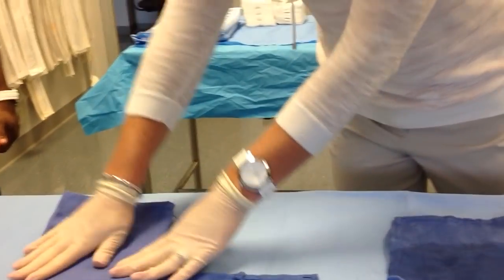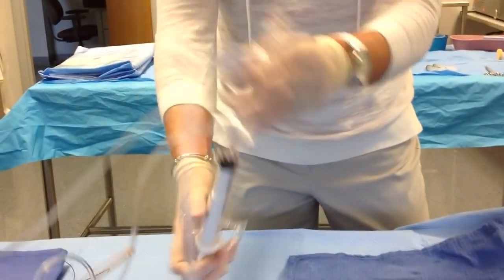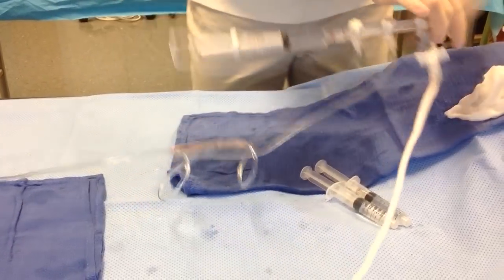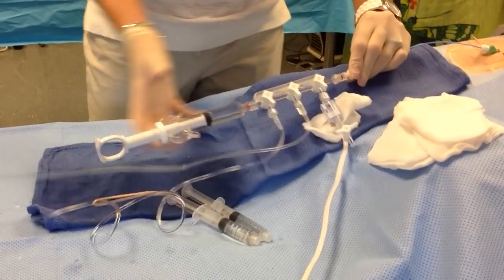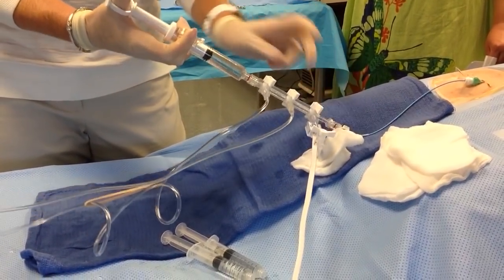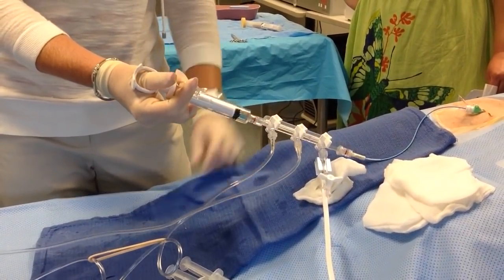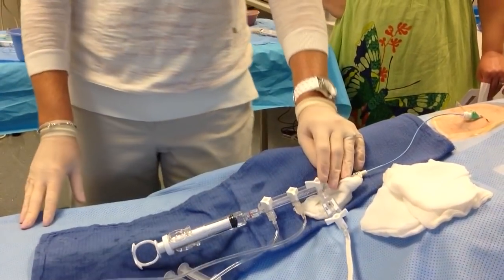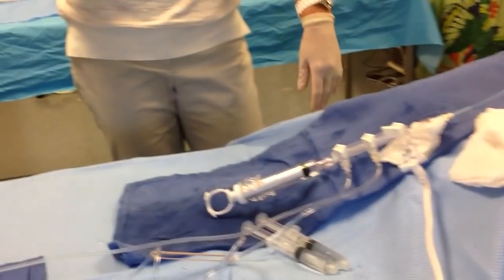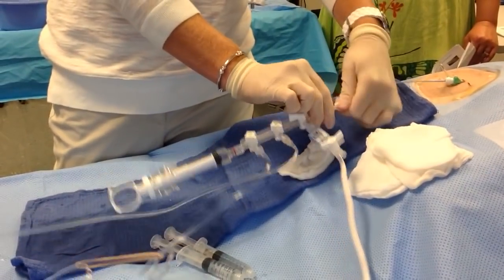To wrap it up. We're going to connect to the manifold here. Okay, check pressure. And we're going to pull back and flush. And now we're checking LV pressure. Yep. So now we're on pressure. They're going to get LV pressure. So they'll get LV, they'll get LV EDP. When they're finished recording, they'll say finished recording. And then we're going to disconnect here.